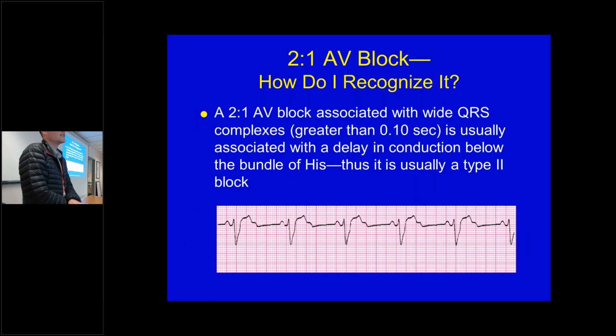It depends on which lead it's in. So we're going, I mean, this certainly could be lead 2. If you have a small R wave and most of your amplitude is negative in lead 2, that means what? Go away from it, which is an extreme axis deviation. Right? It's an axis deviation, right?